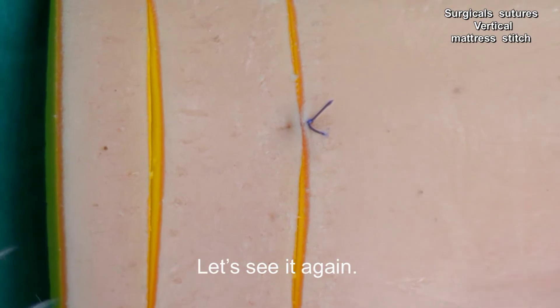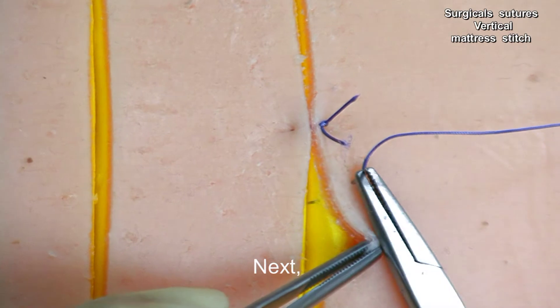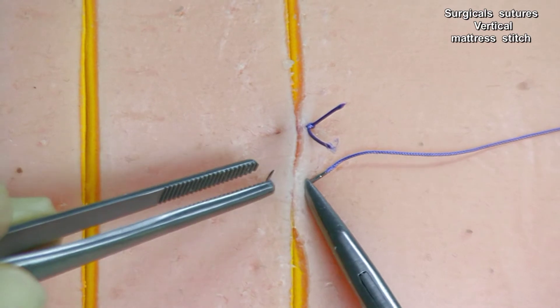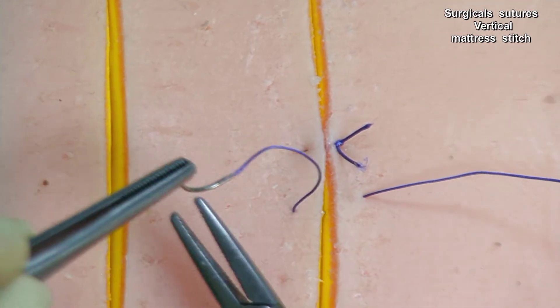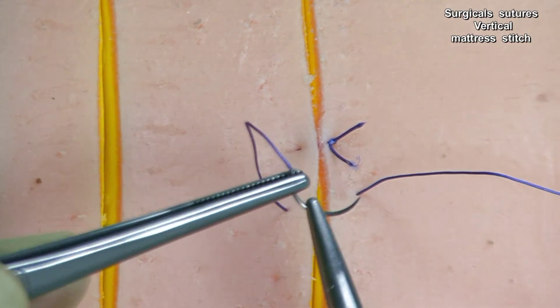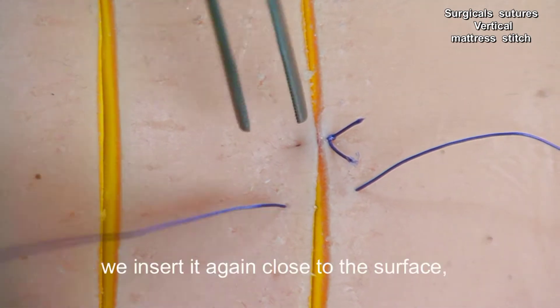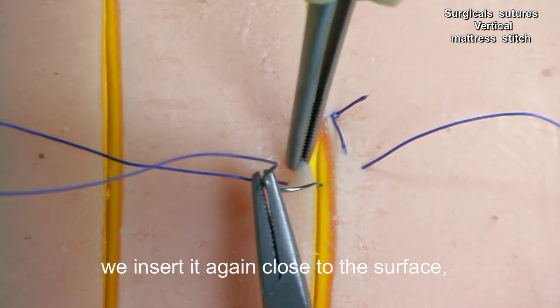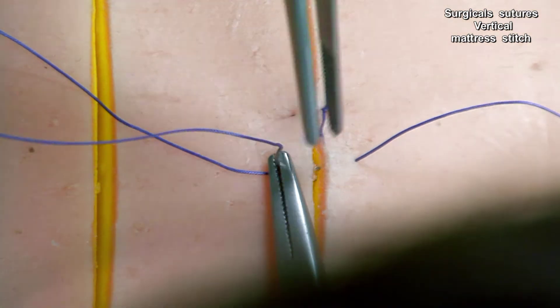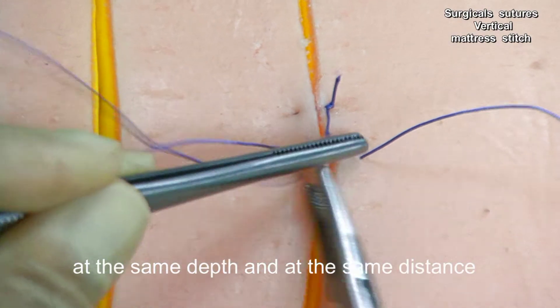Let's see it again. Next, simple stitch. We turn the needle and insert it again close to the surface, taking the dermis layer at the same depth and at the same distance.